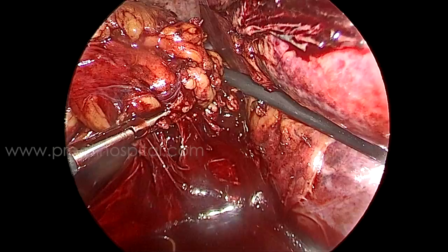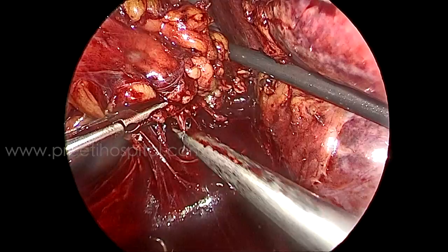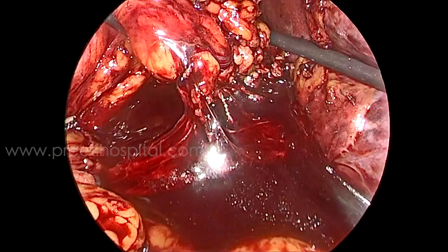During this time around 50 ml will go, but the metal clip is less dramatic. This is a 5 mm metal clip. I am continuously keeping it under stretch, and another metal clip will come — this is only to approximate the edges. Later, these 5 mm metal clips can be removed; they are very atraumatic. Then you can take a nice stitch with Prolene if you want. I kept the second clip and am keeping a third one on top — this will occlude about half of the lumen.